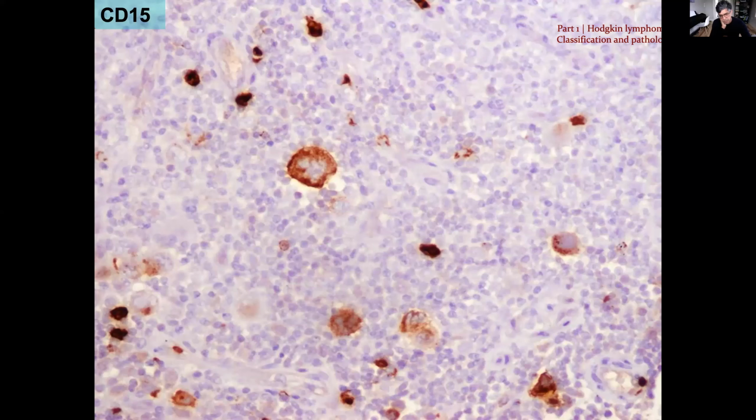So for pathologists out there, when you're looking at CD15, I always like to use internal controls to determine if the immunostain worked well technically. And one way you ensure is to see if you can find high positive internal controls and low positive internal controls.